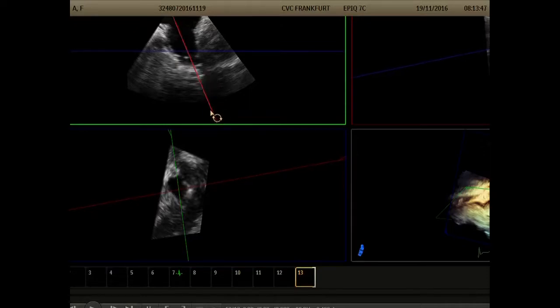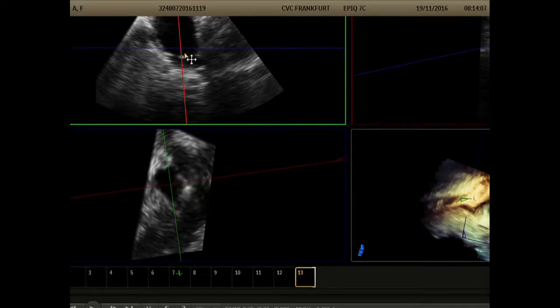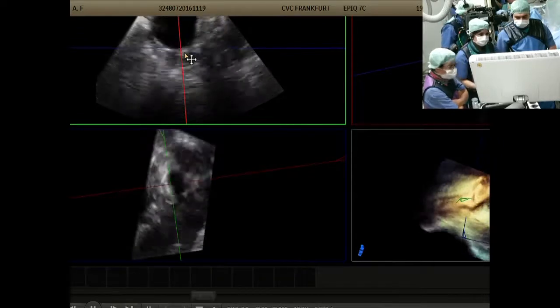They seem rather small for that. And if I just move through those, I can get an idea of what the anatomy looks like. They're very similar. They're both very narrow, very small, and very shallow. So really, as Horst was saying, I can't easily discern a landing zone here, given the shape of the way it goes from a very broad, wide orifice, very oval, where we're getting 35, 36 millimeters, all the way down suddenly to about 16 millimeters. So, Busha, in your own unit, what would you be advising in terms of which device to use? So we really have the St. Jude one available to us on a regular basis. So we probably would not close this appendage, I have to say, looking at this anatomy.